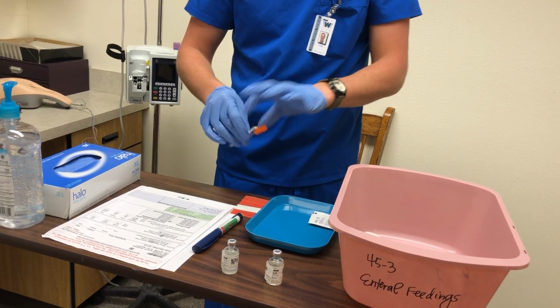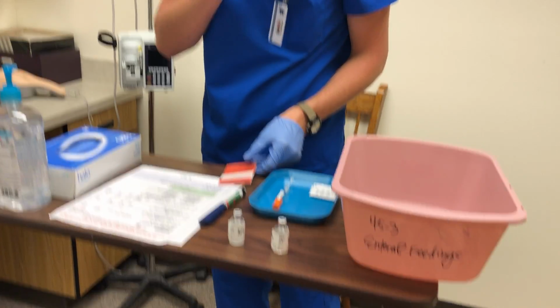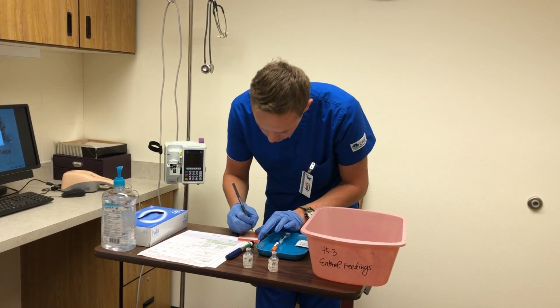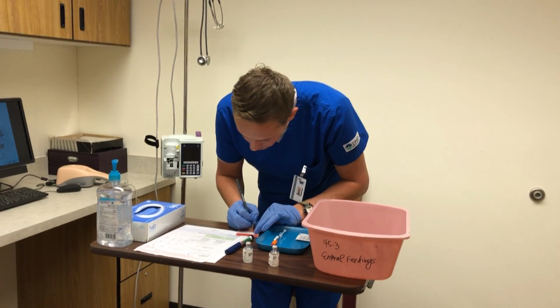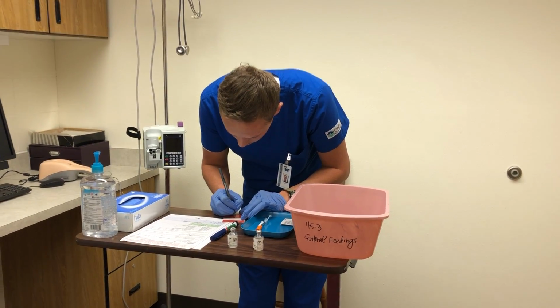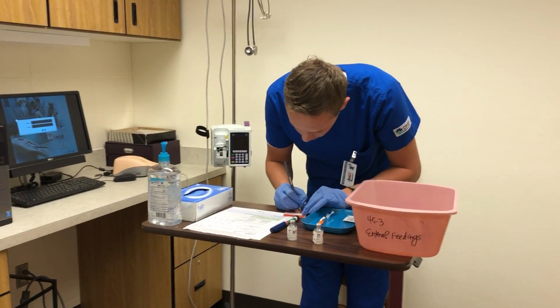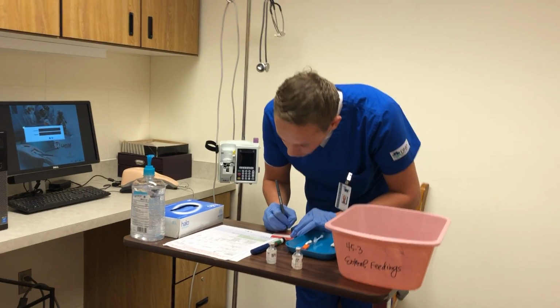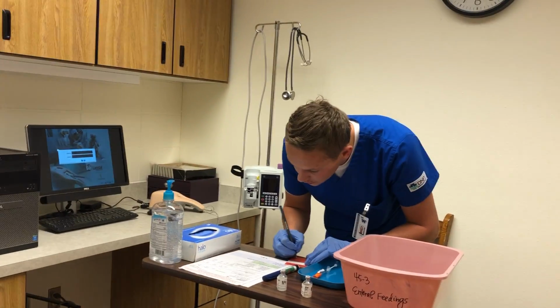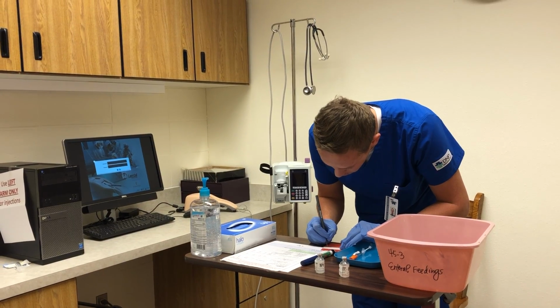Okay. And so that's ready, but then I'll have to write a label for it. So the first insulin in it is the NPH U100, and there is 15 units of it. And then the second one is the R insulin U100, and that is 10 units.